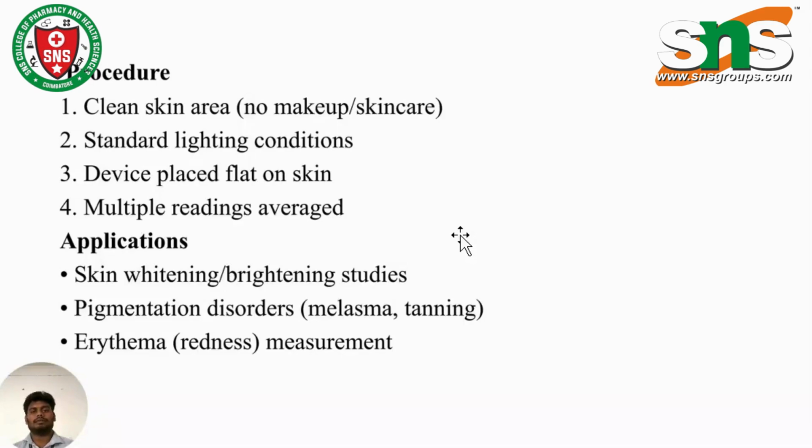Tanning denotes brown and black color representation, and erythema is hemoglobin representation. It is a redness measurement.